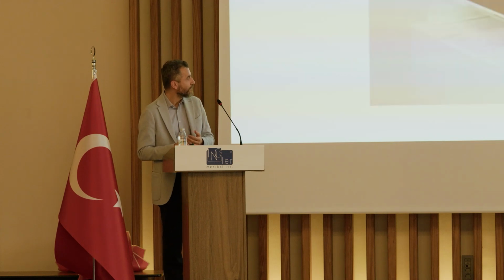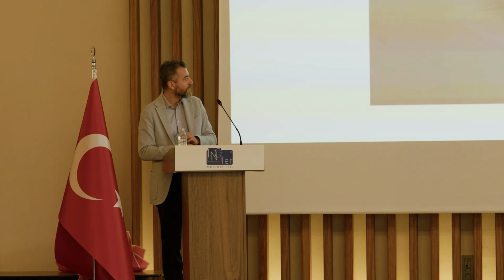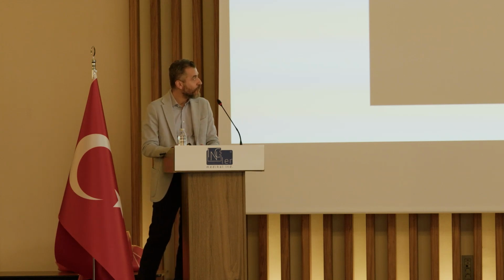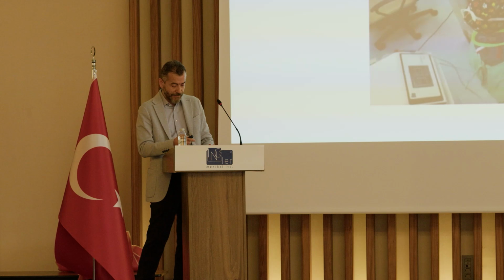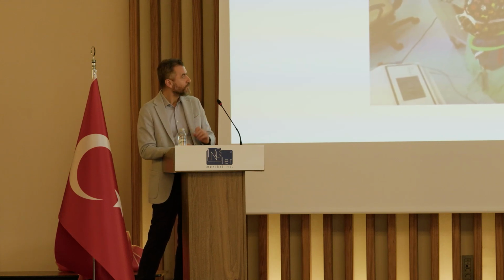So I know the technical details of my instrument, and I select my lithotripter based on what the device lets me use. So this is the Lithobox. This is the mini PCNL procedure. We are applying the surgery through a 16 French sheath, and the nephroscope is just 12 French, and the working channel is just 5 French. And this is the ultrasonic lithotripsy probe that we apply to disintegrate the stone.